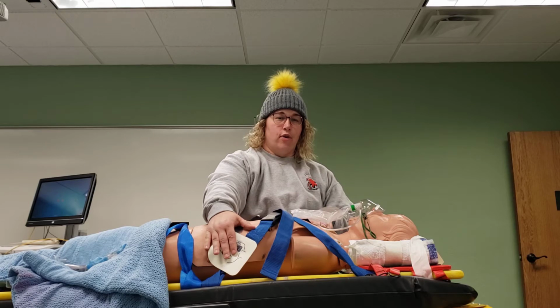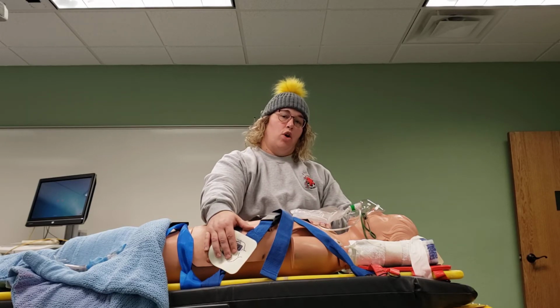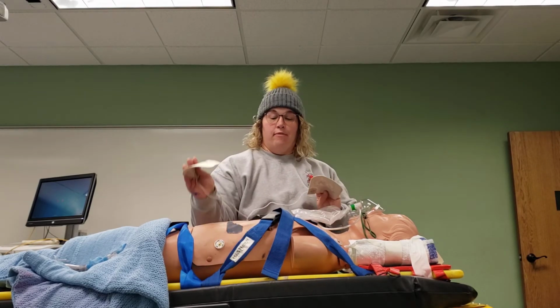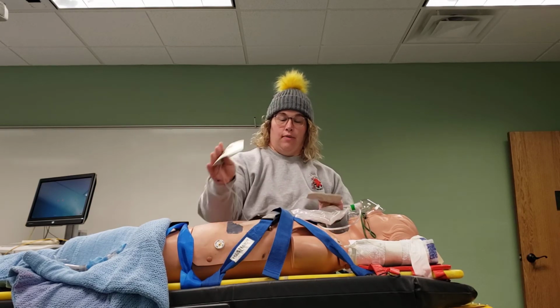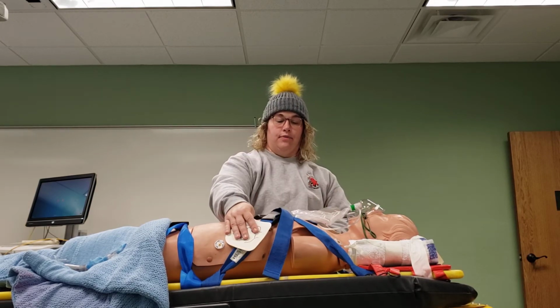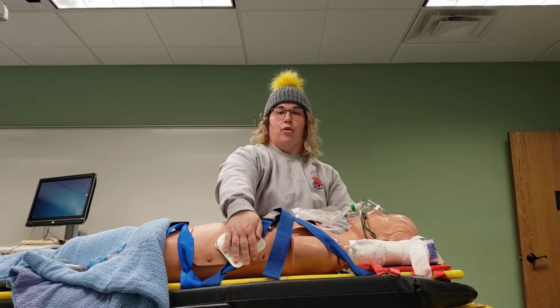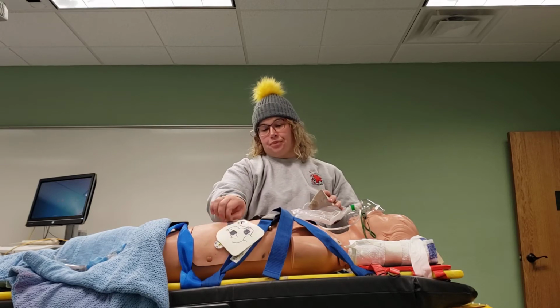There are other formations that you can utilize, front and back, but we're not going to worry about that right now. Let's get one down of muscle memory: I'm just going to always go to the left lower and the right upper. We call it lead 2 because that is lead 2 on our monitor, but that just diagonal formation down every single time so you're doing it correctly.